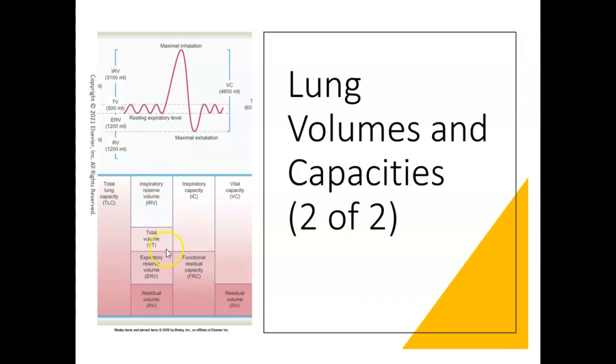So you're going to have to do some math to figure out how to find this missing value. And if you plug them into the chart, it'll be really clear which ones you have to add together and subtract from to make up this number here. Okay, so having this schematic written out on your flow sheet is important.